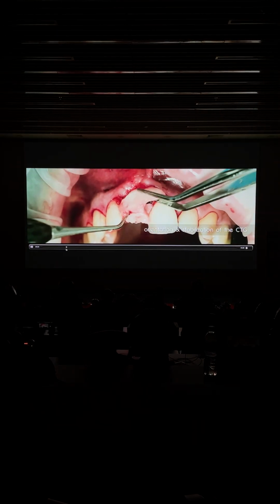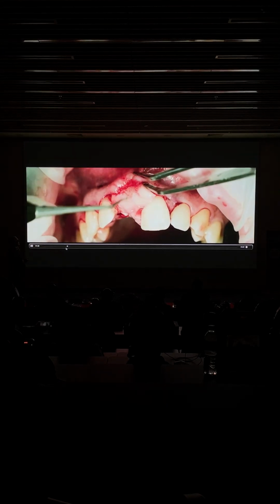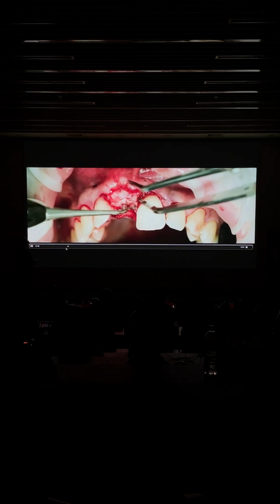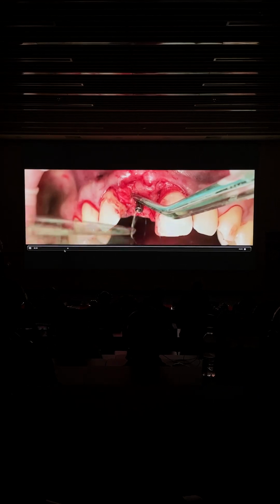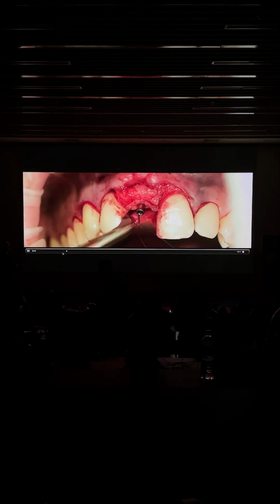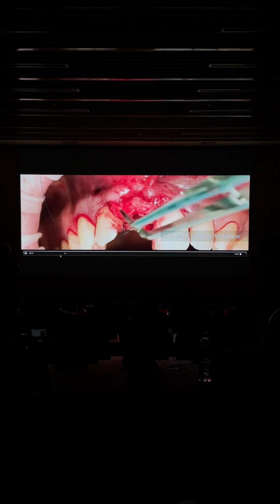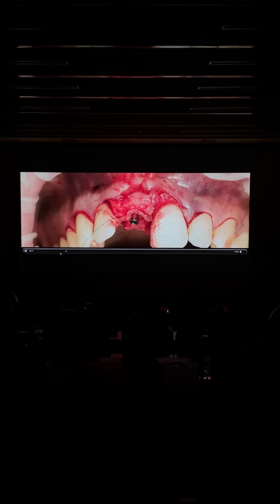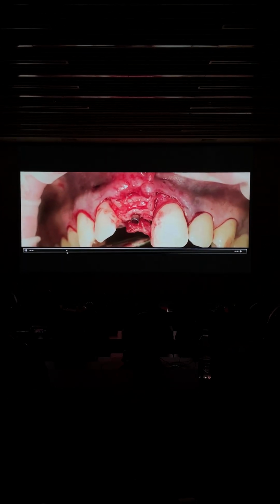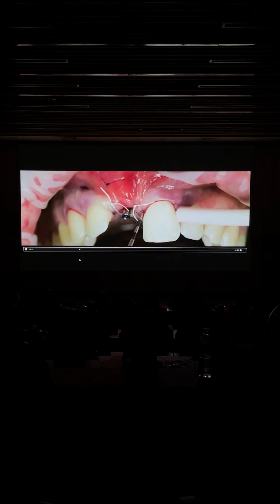So I always make, you can see at the beginning you try to fill with soft tissue the buccal bone defect. You don't need that. If you only graft crestal, it's more than enough. By the time that you are pushing the tissue, and I will show you some cases later on, when you have limited amount of soft tissue to graft from, you will see a great result.